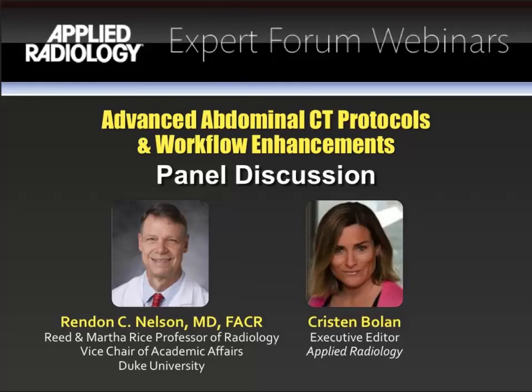And can decreasing the slice thickness increase the dose and decrease the noise index? So first of all, aside from the noise index, if you want to go to a thinner slice and you want the same image quality, then fundamentally you have to go up in your radiation dose to get the same noise with a thinner slice. If you're comfortable going to a thinner slice and going to a higher noise level, then you will have less of an increase in radiation dose by going to a thinner slice.